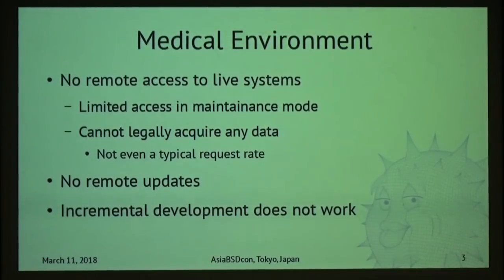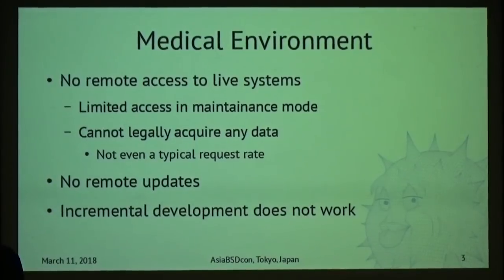You cannot legally get any data off these machines, not even something as simple as a request rate, because everything is considered medical data and it's illegal to get it off the machine. The usual incremental development model we mostly use just doesn't work there.